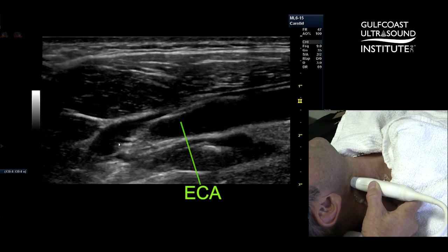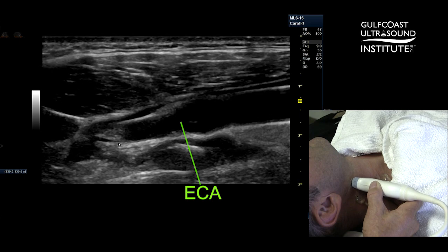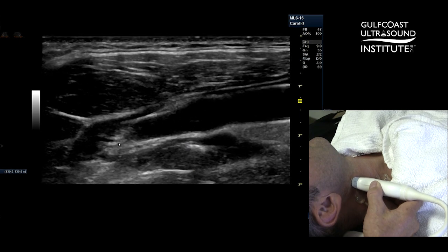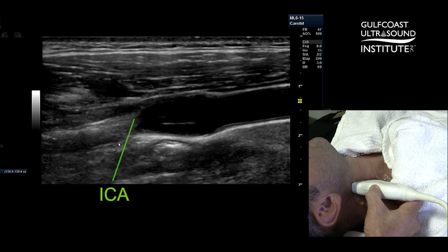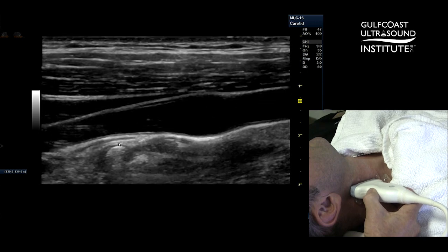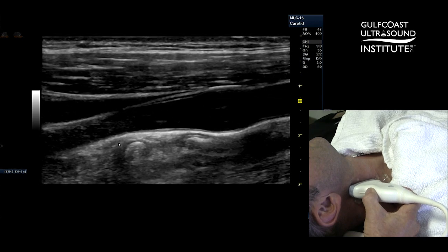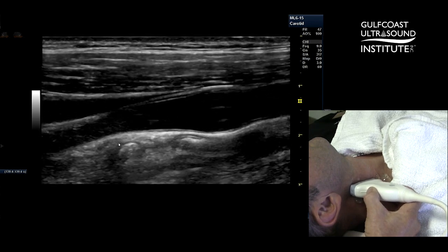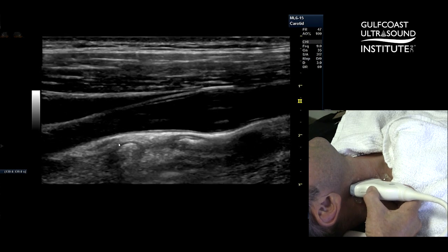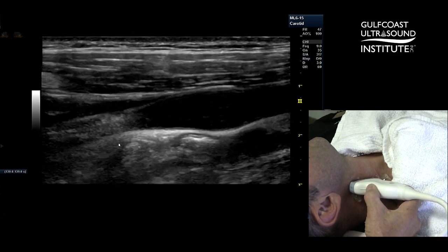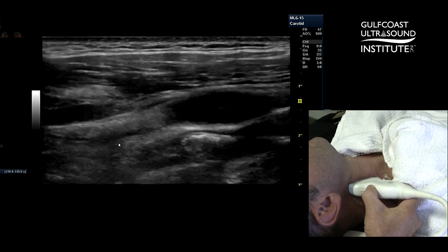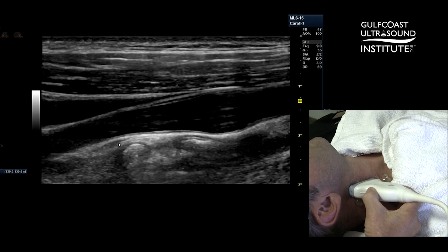There's the external carotid coming off the distal common carotid or the bulb. Again, when I tip that transducer back in a posterior fashion, I'll insoninate the internal carotid artery. In a normal patient like this it's all very clear-cut and straightforward, but these methods can be really useful when there's extensive disease and it becomes difficult to differentiate the internal carotid from the external carotid. External and then internal carotid artery.